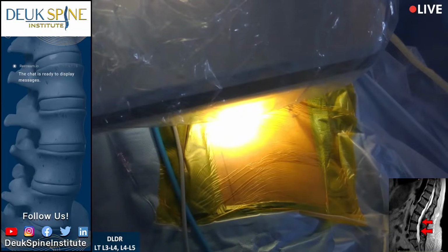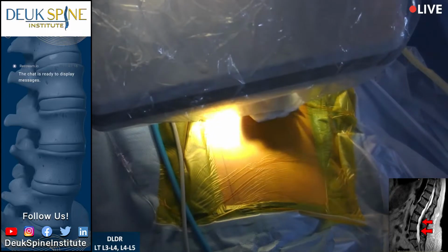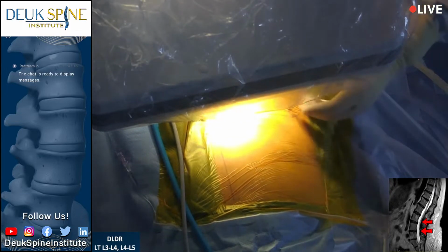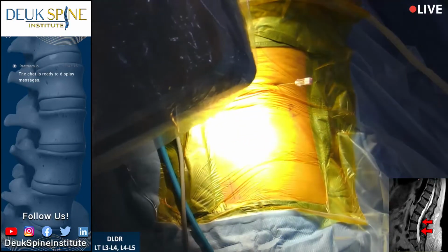Okay, welcome back. So the first step in this surgery, the Deuk laser disc repair, is to guide a needle from the outside world where we are down to the disc herniation. And that's what we're trying to do right now. Shot, lateral.